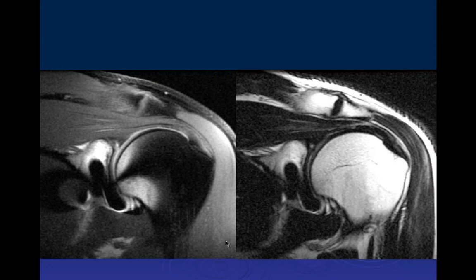Yeah, so there's... And where's the metal artifact centered? It's along the inferior glenoid. It's really the anterior glenoid, right around the anterior glenoid. And this is a Bristow procedure. John, do you want to tell us what a Bristow procedure is and why it's used for anterior dislocation?